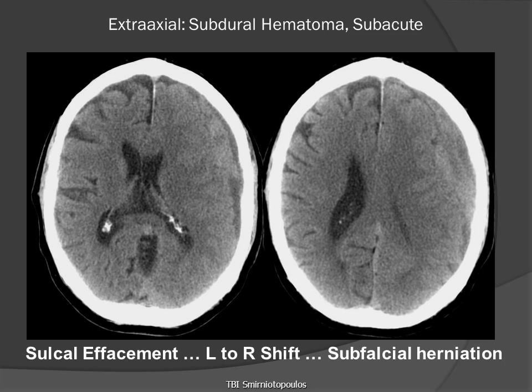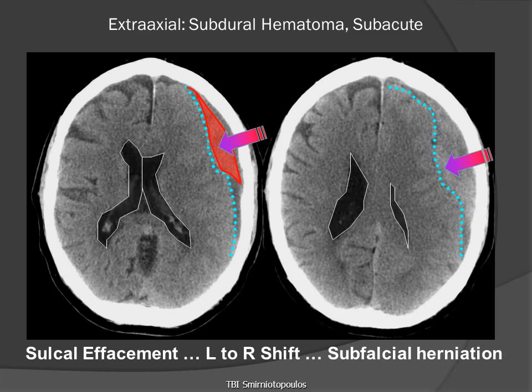If we look at this pair of axial cross-sectional CT images without contrast, we notice immediately an asymmetry in the size of the cerebral sulci, which appear to be effaced over the patient's left hemisphere. There is also an extra-axial collection that is almost isoattenuating to the underlying gray matter. We can see the interface between the extra-axial subacute subdural hematoma and the underlying brain. The hematoma is pressing on the brain, but because of the pre-existing enlargement of the subarachnoid space, there is relatively little displacement and shift of the ventricles.